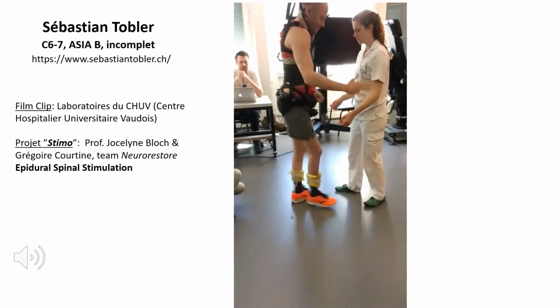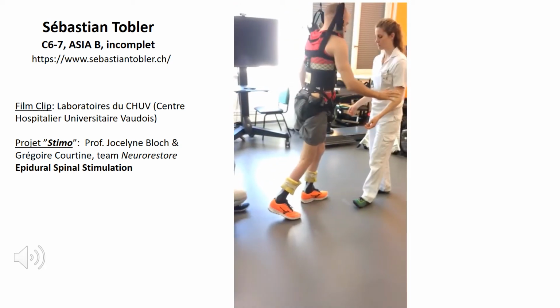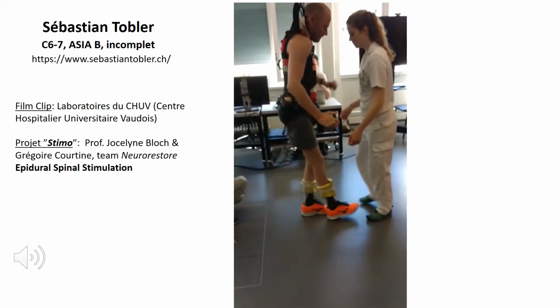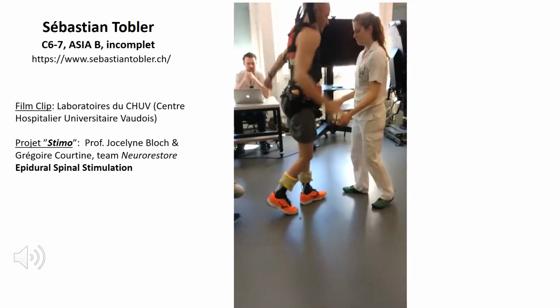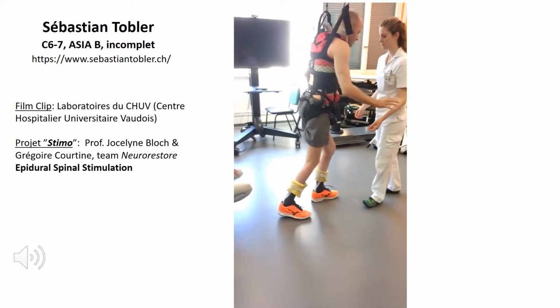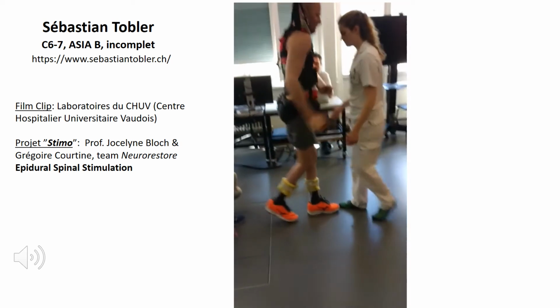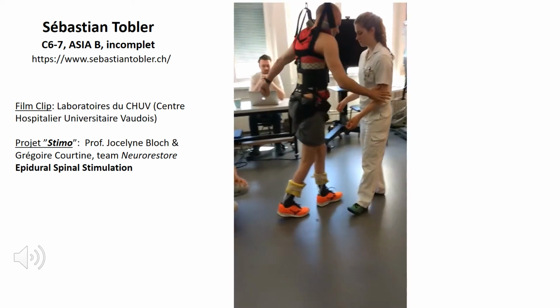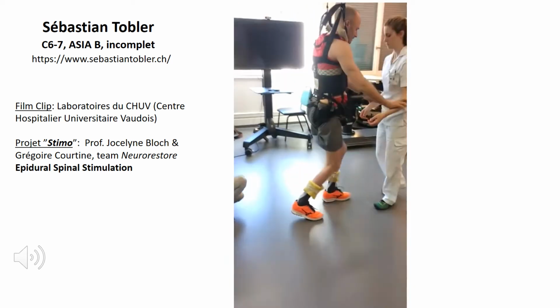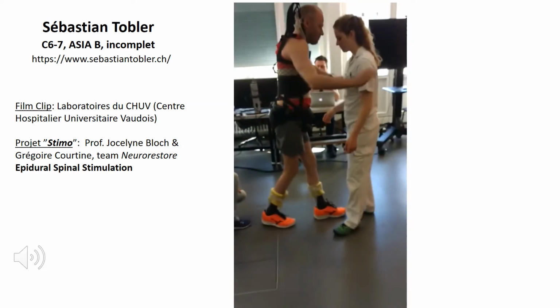And so this is interesting because it is the transition and combination of a patient-driven approach with a technologically driven approach. Unfortunately, the CAVE number here, we would have to evaluate as greater than 1. That's because this system is very costly, it's not very available, and it takes a lot of time to set up and get the patient going. Now, we want to reduce all of that, and the team in Lausanne in Switzerland is working to do that. They are making great strides.